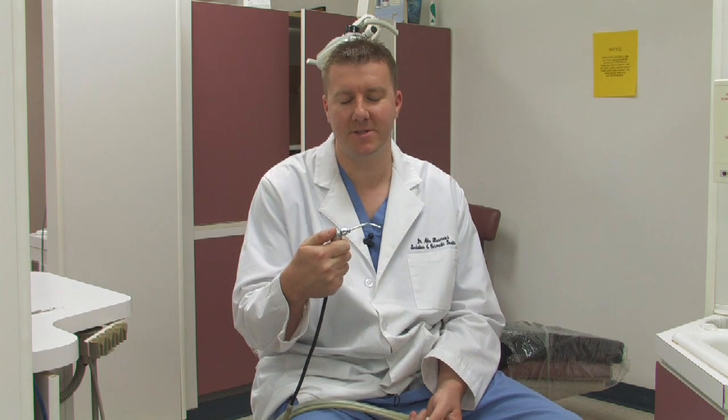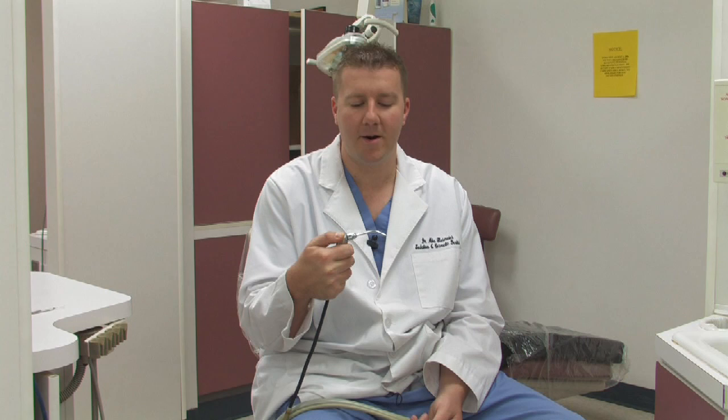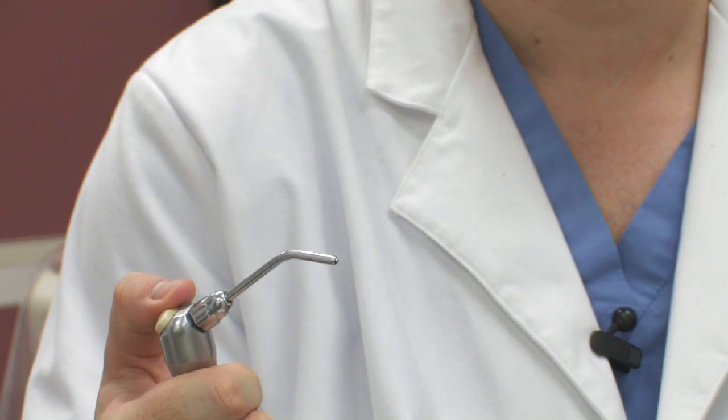This is what we call our air water syringe — probably one of the most important ones. This allows the assistant to eject air, water, or both into the patient's mouth. Oftentimes while the dentist is working, whether taking out a cavity or removing something, the air can help keep the field of view clear and make the patient comfortable. The other button ejects water to flush out irritants or debris.